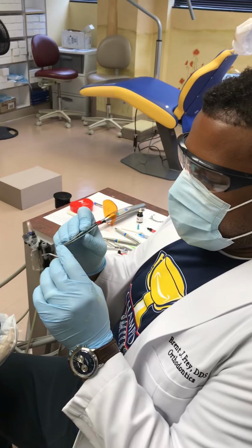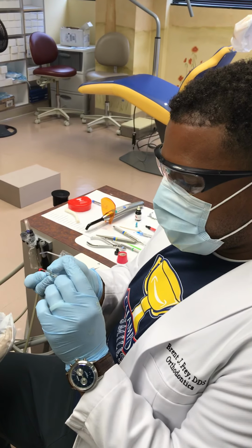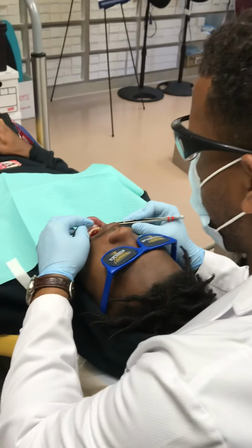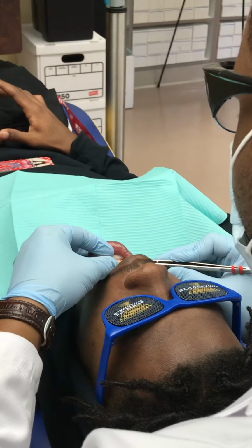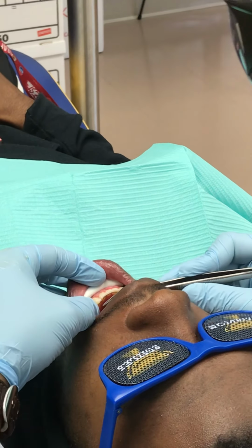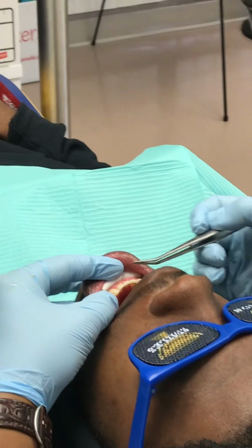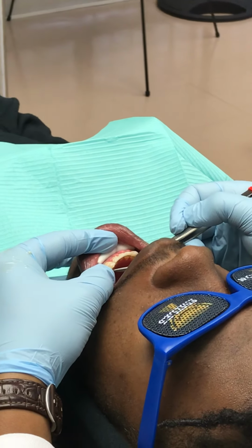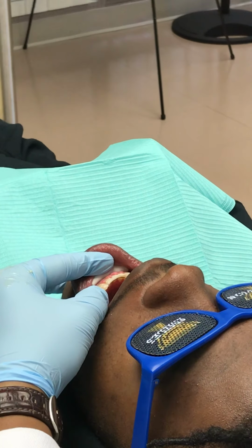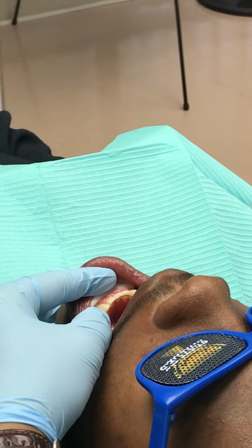Okay, so we had a little technical difficulties. Had to change the material setup just a little bit. Basically, the wrong syringe tip was on the syringe, and so that didn't allow the adhesive to express out of the syringe properly. So we switched that up. The lesson of that is just make sure that you're using the right equipment.